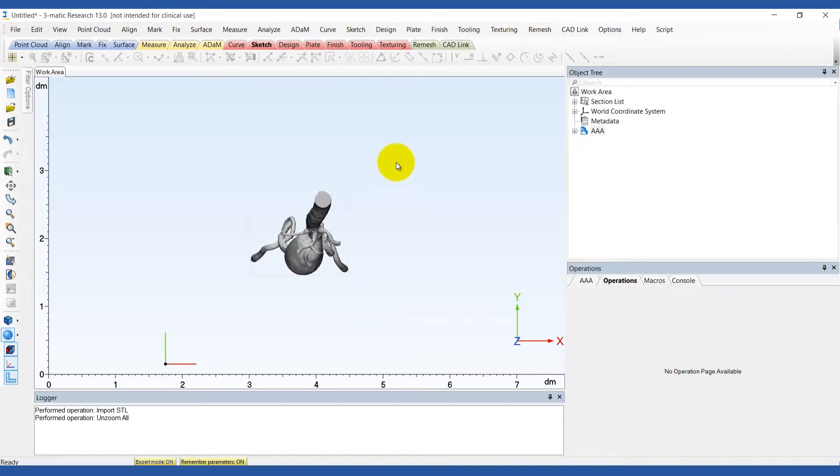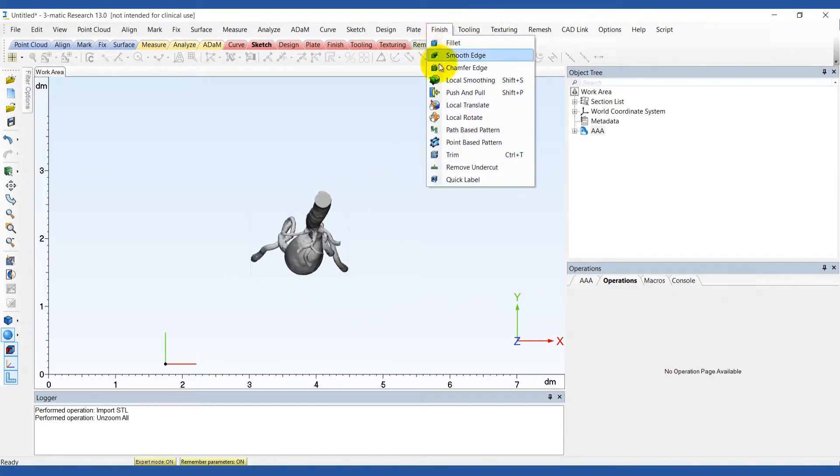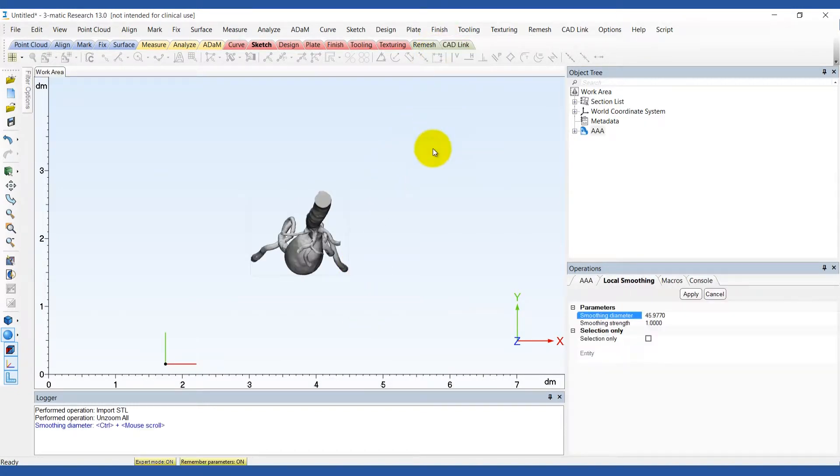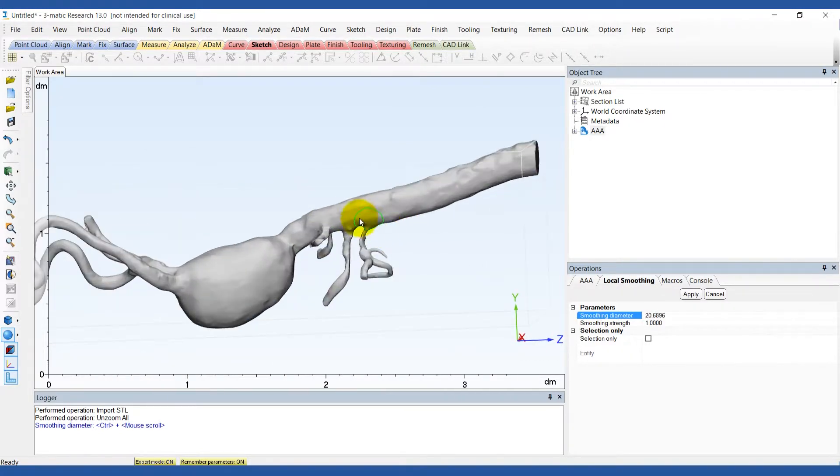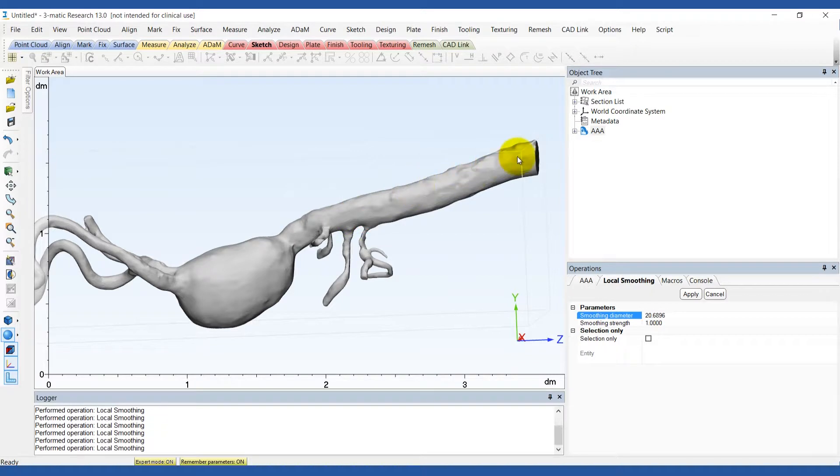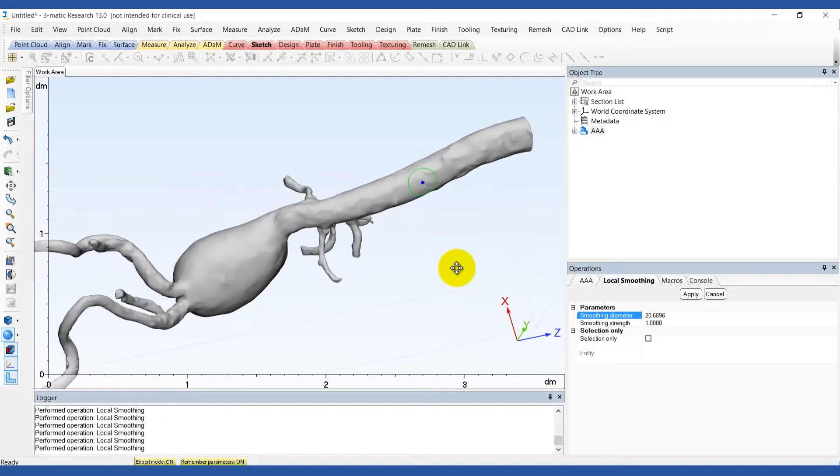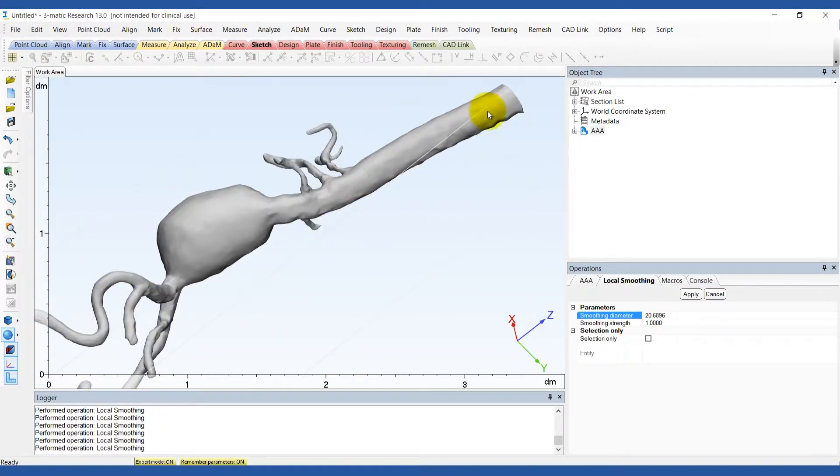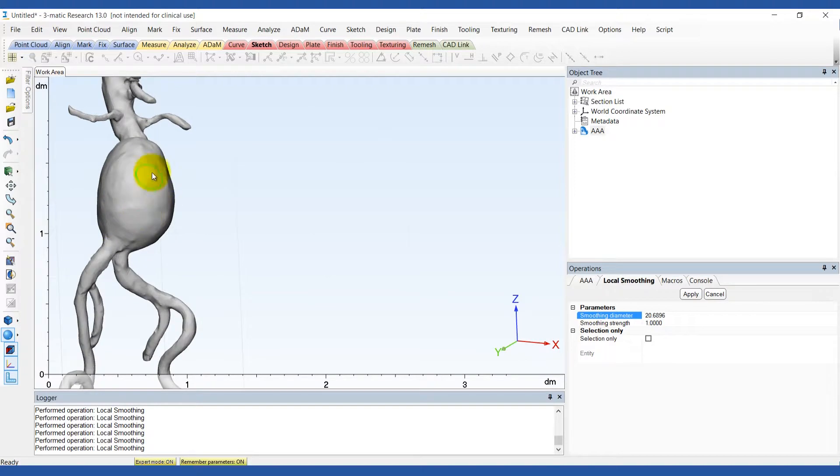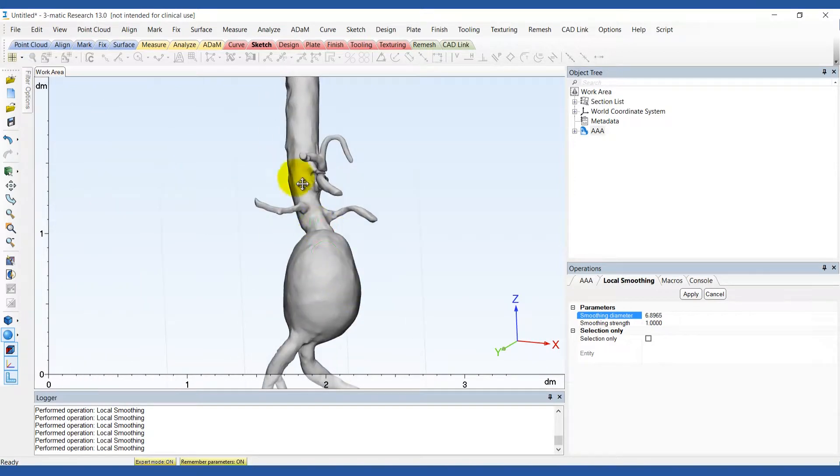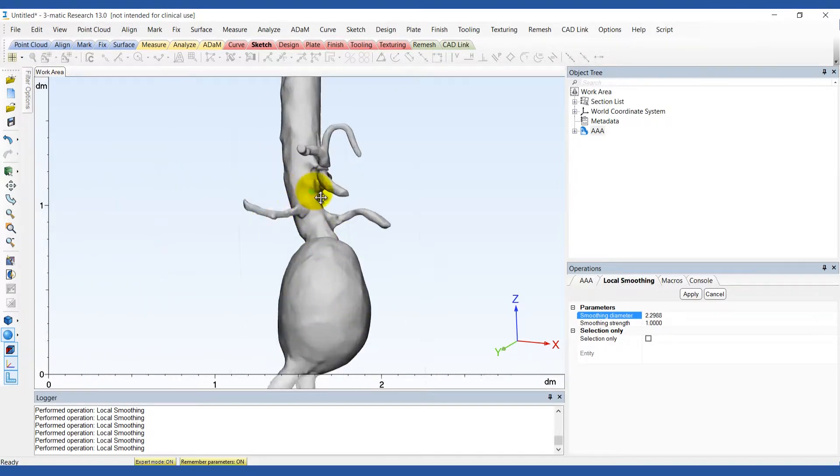Use the local smoothing tool under the finish menu to optimally prepare the model for printing. Smooth all the rough areas on the surface of the model. You can simply click and drag to apply the smoothing and you can change the size of your brush by holding down the ctrl key and scrolling with your cursor.